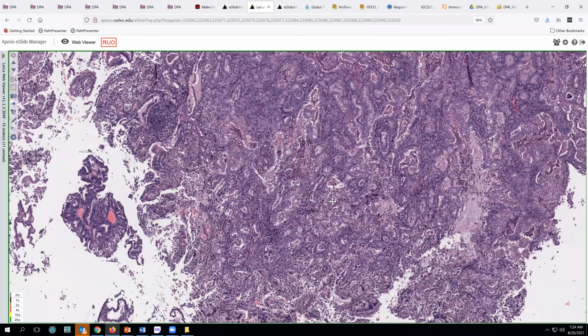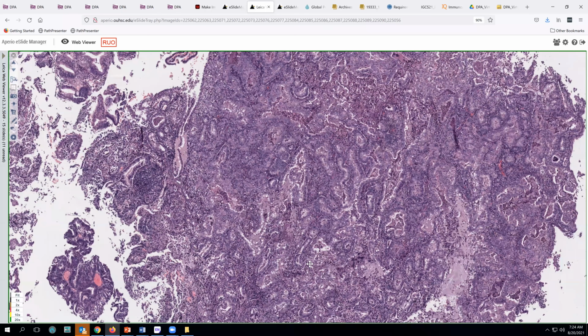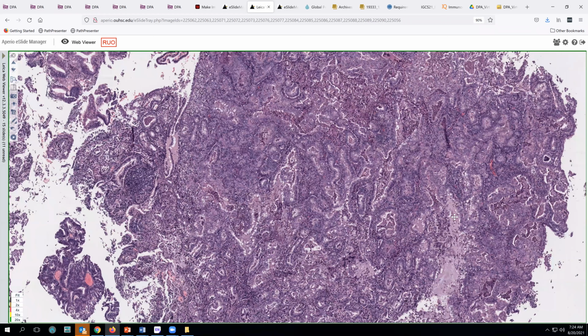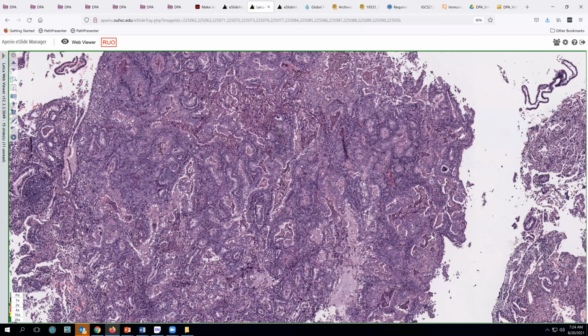While grading is a useful prognostic indicator by and large, there are some instances where we can miss areas of serous differentiation, and that clearly changes the prognosis in these patients. So we routinely do a p53 stain.